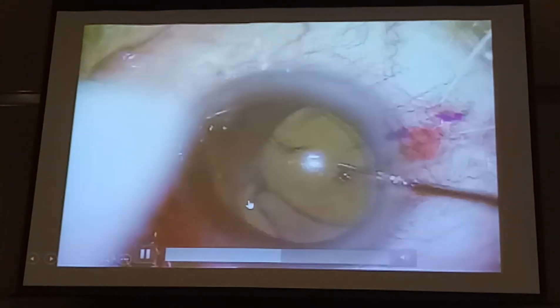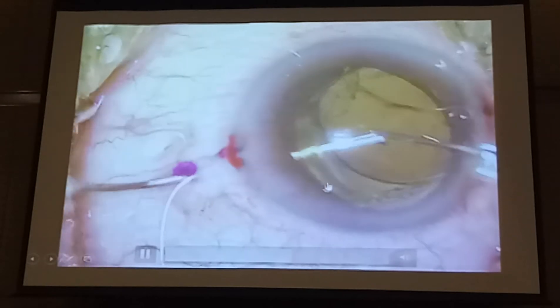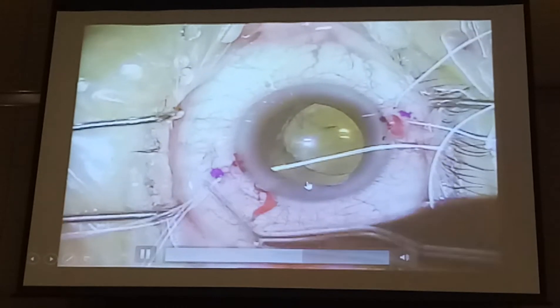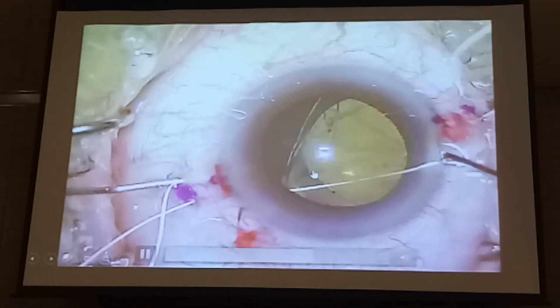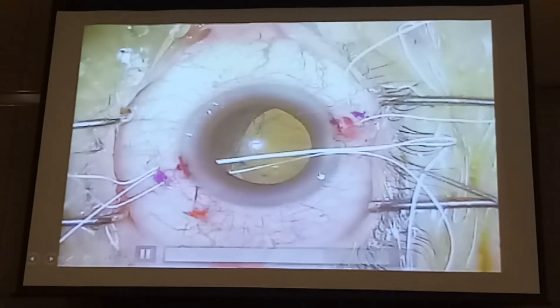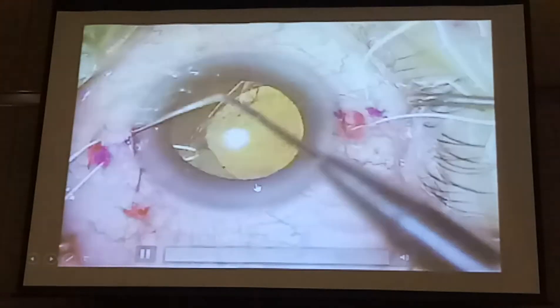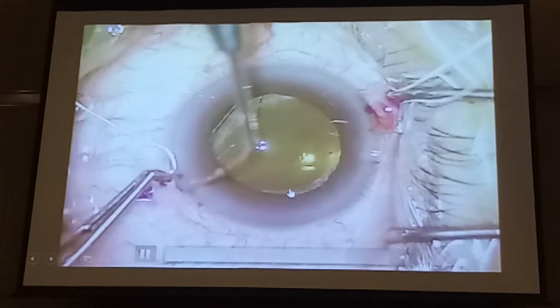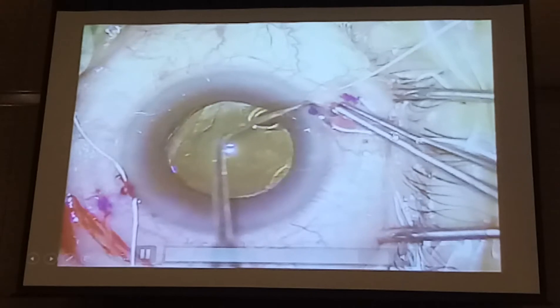This is a suture snare — with one paracentesis here to snare a free segment of the suture. Now the second one: the needle goes above, not through the back like the first one. Then it snares the other end of the suture over the haptic — so one under and one over. The zonules are intact still — they are stretched and loose. One under. Just one paracentesis here, thread the free segment through, snare it out. The second one, position point — this goes over. Pull out the snare to bring this other end of the suture through.